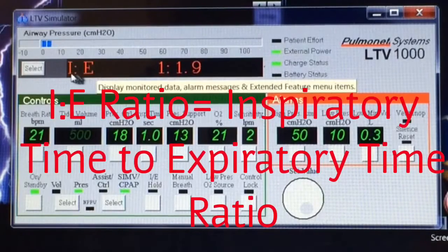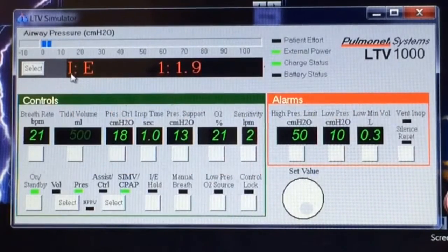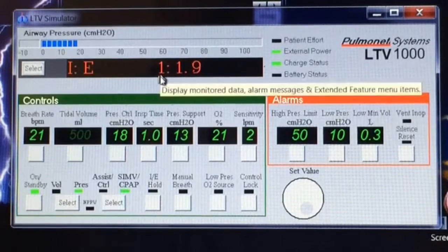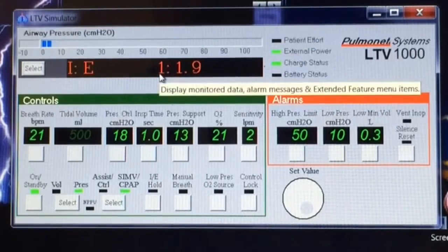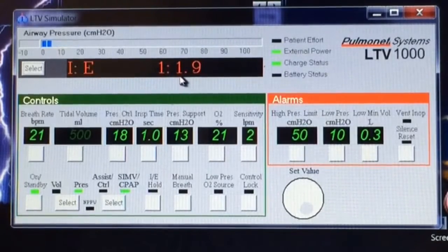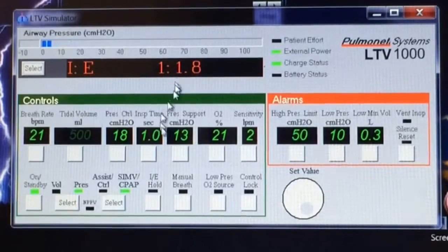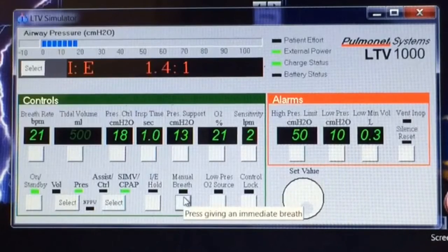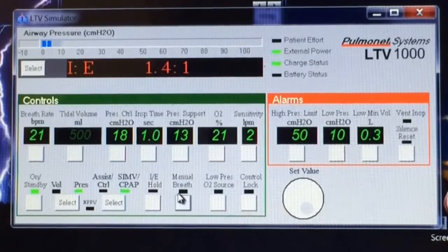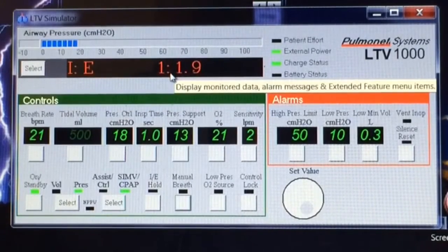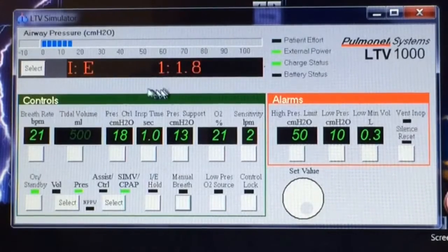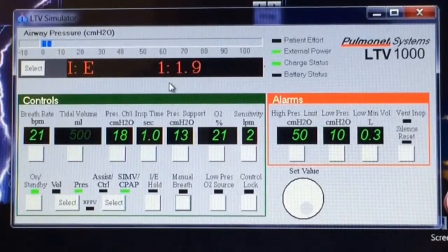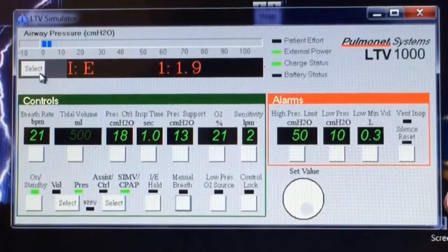The I to E ratio — that's the inspiratory time to expiratory time ratio. In this case, for every period of time they breathe in, they're breathing out 1.9. If they take an extra breath, that will change, and it does change with every breath. It's really important in a setting where we can control the I:E ratio, but with this machine it changes with each breath, so it's important to record it, but we can't do a lot of other things with it.